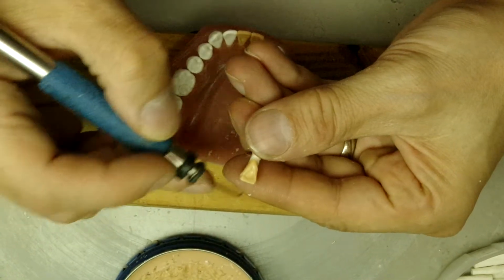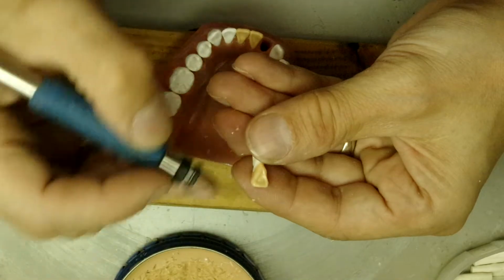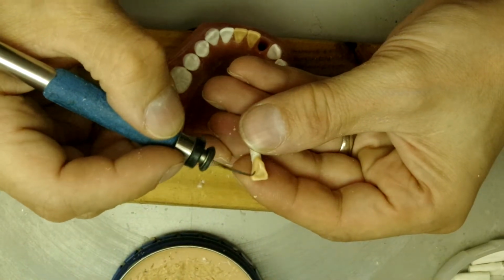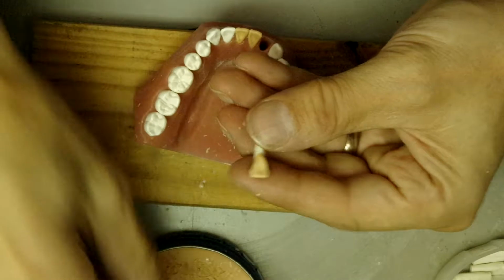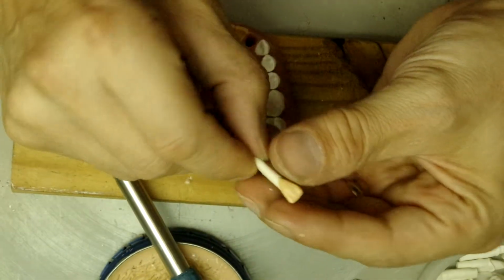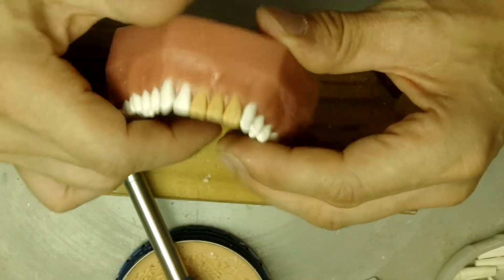Still little voids that we need to fill. And we have a nice lingual area of the tooth. That's it. So we put it back and double check our work.